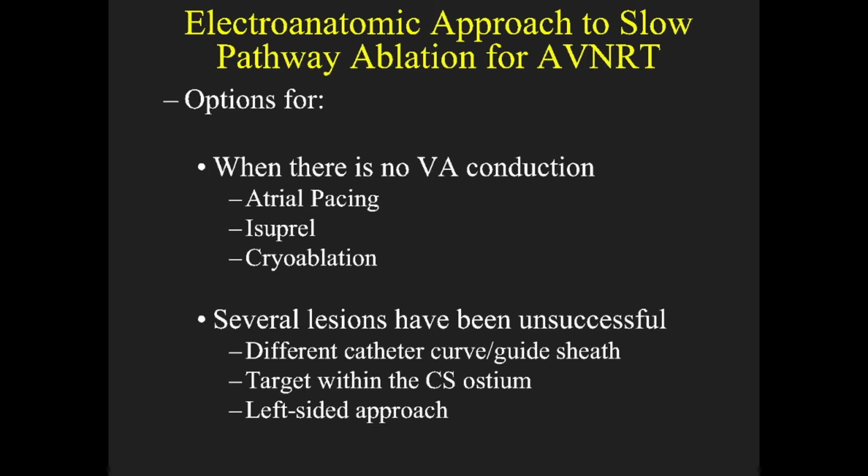And so you can atrially pace as long as you recognize the difference between capture and the pacing stimuli with junctional ectopy. And very rarely you could use cryo, which doesn't result in junctional ectopy, and you can pace and determine if you got rid of the slow pathway.